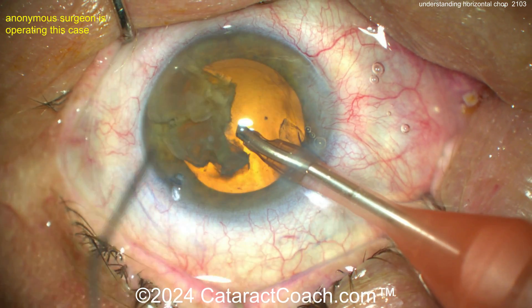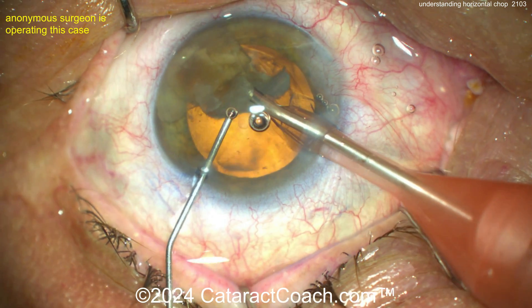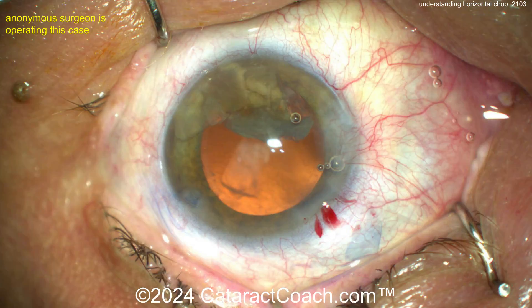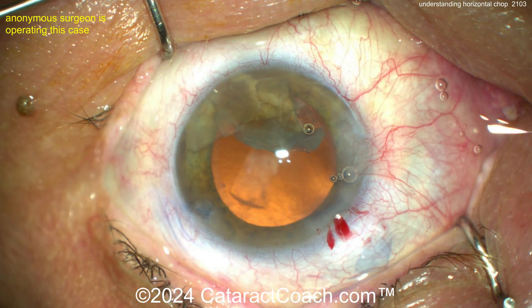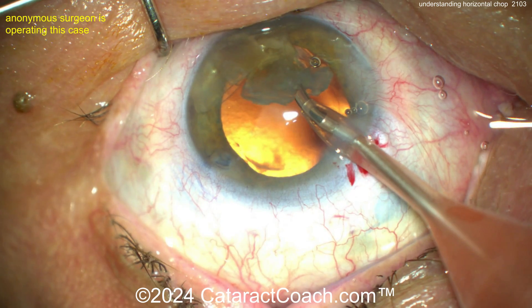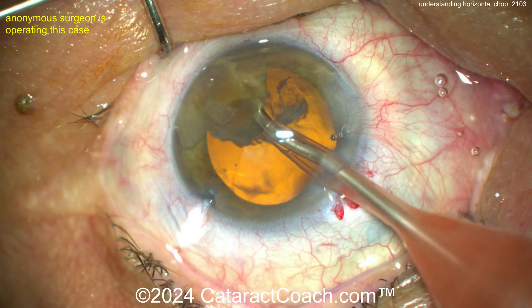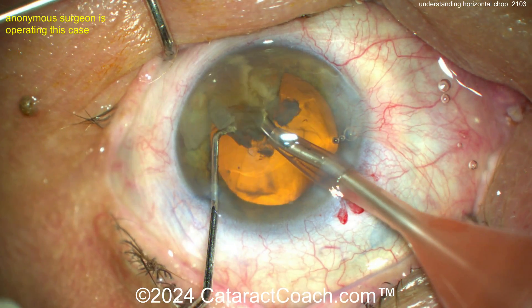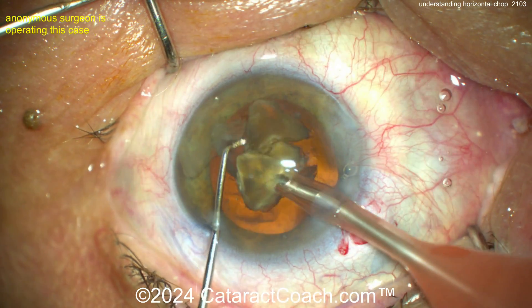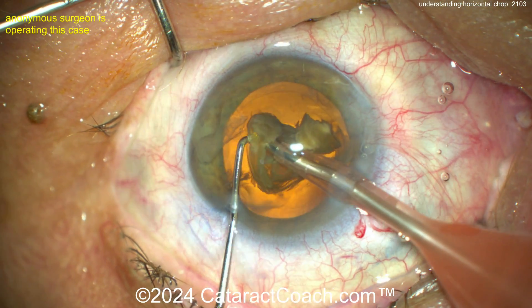With the last piece in the bag and not much cortex remaining, be careful — don't let the bag come up. Injecting some viscoelastic is probably a smart move. Good surgery, young doctor. Once you remove that last bit of lens material, be careful: when there's nothing weighing down the capsular bag, unstable fluidics can cause the posterior capsule to come forward. If it touches the phaco probe tip, you can pop the capsule. A little more chopping — and that looks really nice.